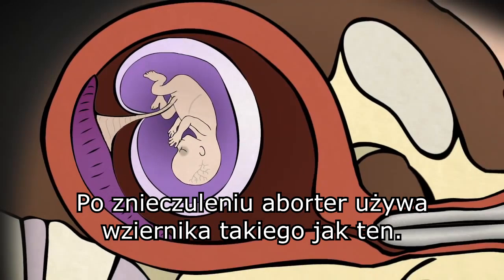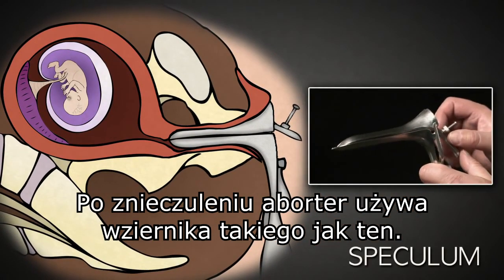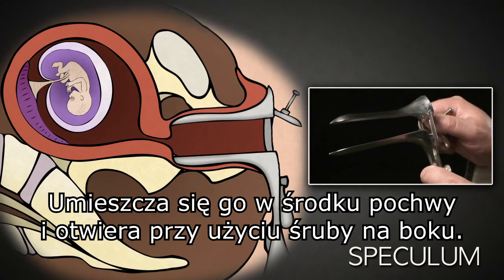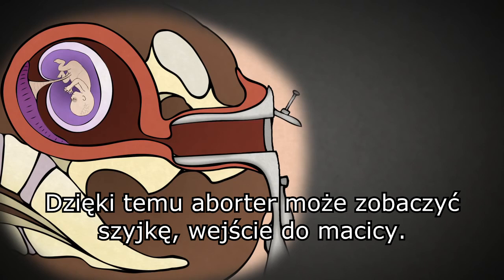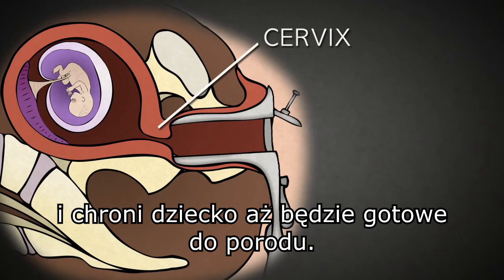After administering anesthesia, the abortionist uses a speculum like this. This is placed inside the vagina and opened using this screw on the side, allowing the abortionist to see the cervix, the entrance to the uterus. The cervix acts as a gate that stays closed for the duration of pregnancy, protecting the baby until it is ready for birth.